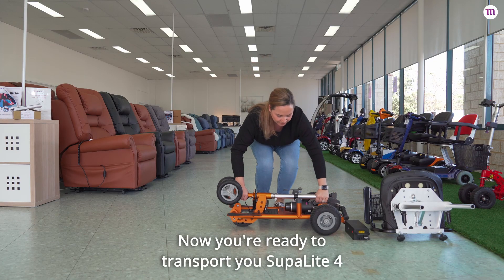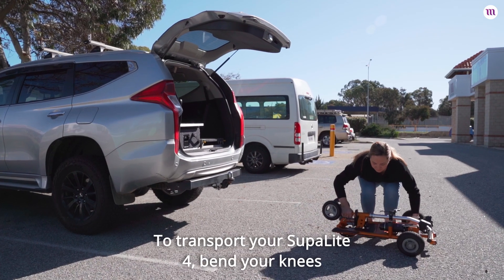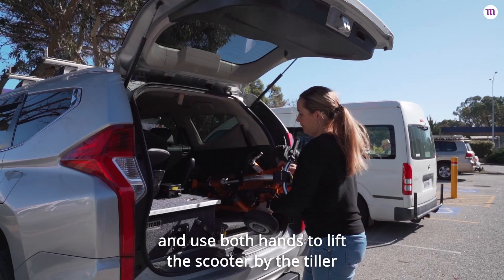Done. Now you're ready to transport your SupaLite 4, lifting less than 15 kilos. To transport your SupaLite 4, bend your knees and use both hands to lift the scooter by the tiller into the boot.